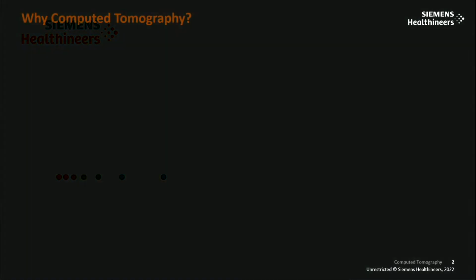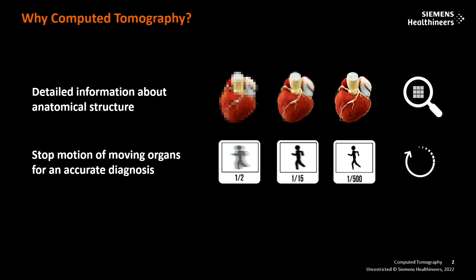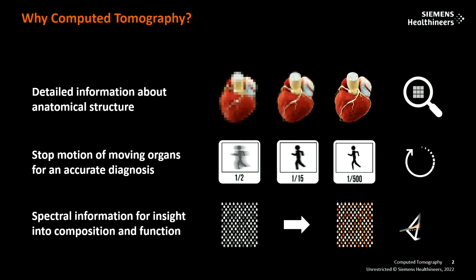So I always talk about CT. I have to start somewhere, and when we think about CT, we think about three main things. It's about detailed resolution. In this space, it's coronary plaque, the walls of the valves, being able to see edges of calcification with confidence. When you do that in conventional scanning, it's a trade-off between radiation dose and spatial resolution information. It's always a balance and a compromise.